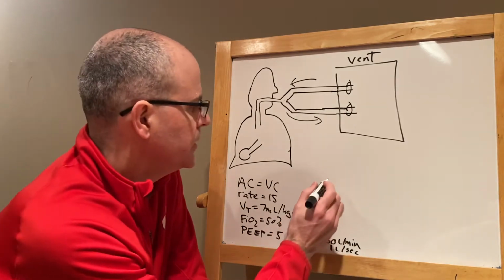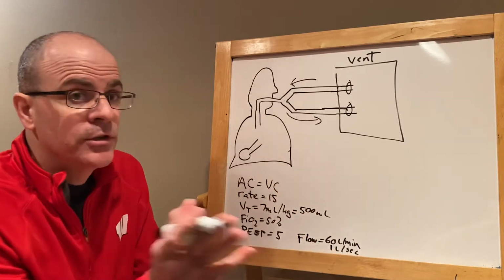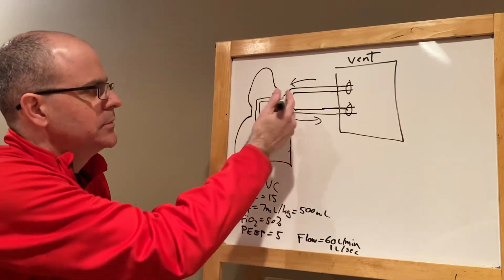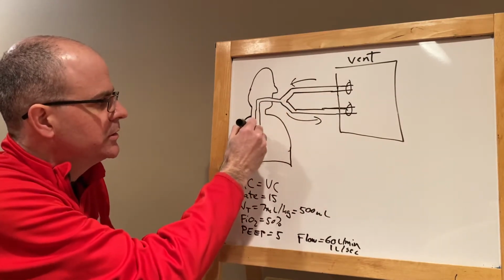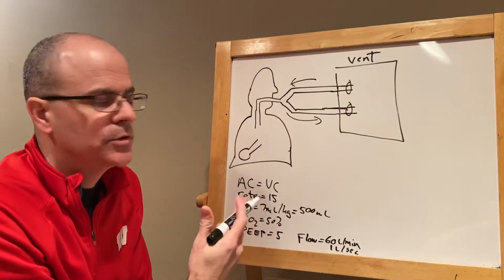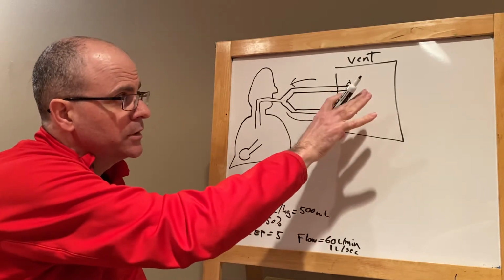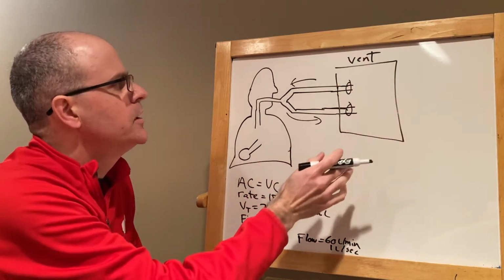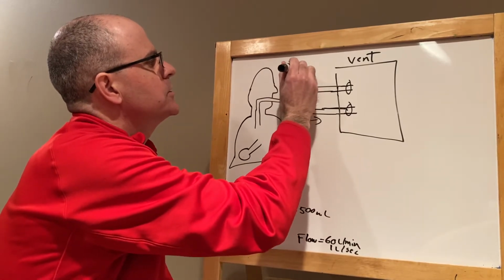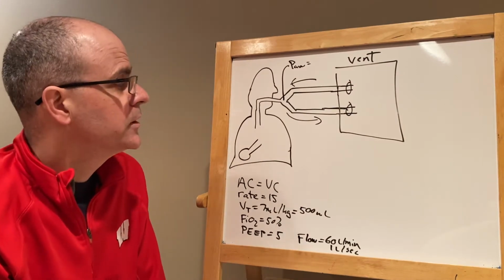First of all, the ventilator will be keeping track of the airway pressure. The ventilator can do that in different places. You can do it inside the vent circuit. You could do it at the Y. You could even put a tube through the endotracheal tube and measure it in the trachea. Nobody really does that because of problems with condensation and mucus plugging up the tubing. Most modern ventilators are measuring pressure inside the circuit, but for our purposes, let's assume we're measuring it at the Y, because I think it's just a little bit easier to visualize when you're new to how ventilators work.